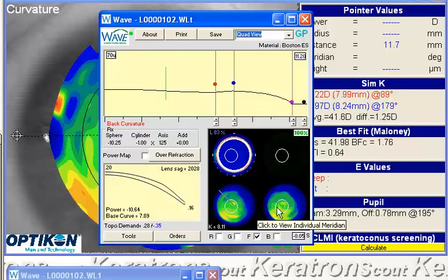If you're unsuccessful with that, I would probably then go to a semi-scleral design. I tend not to go to full sclerals. I tend to like that 13.5 to 14.5 millimeter diameter, and that lens will undoubtedly center quite well for you.